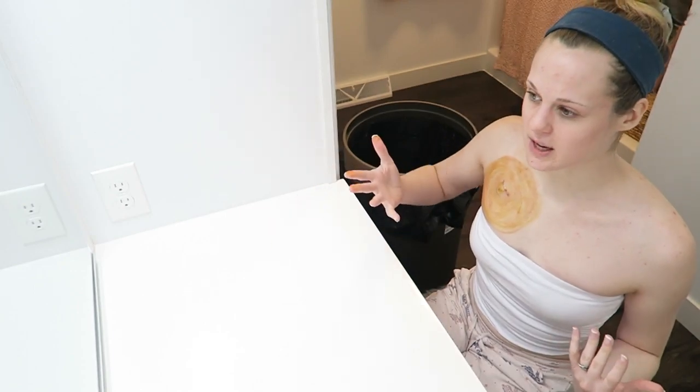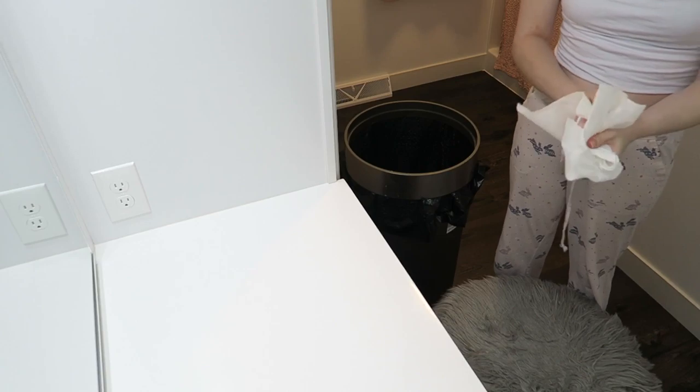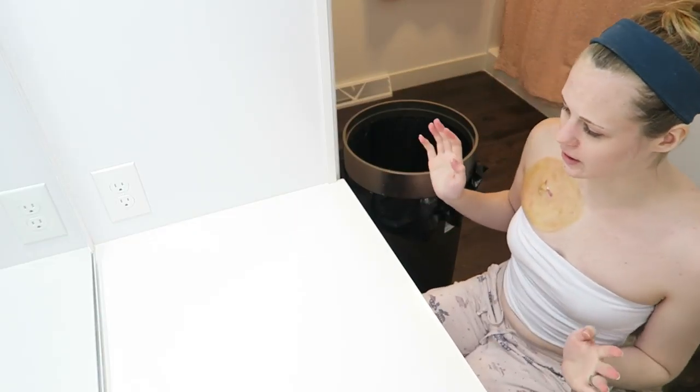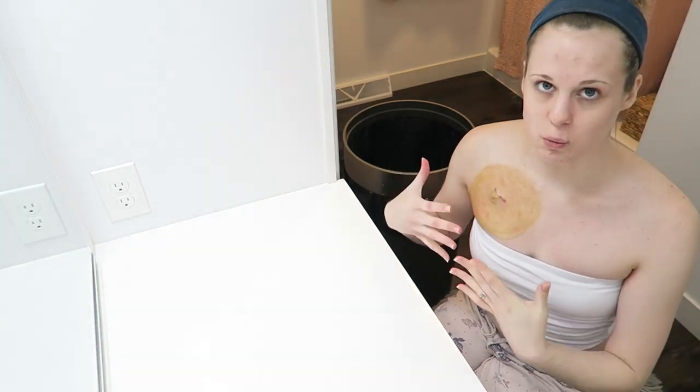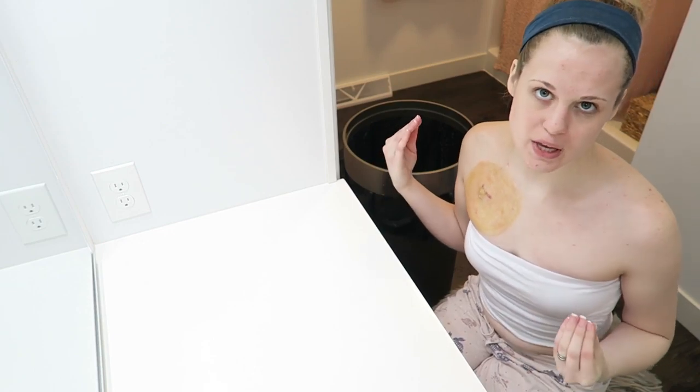So now that my hands have betadine on them, I'm actually just gonna go ahead and wash my hands again. Okay, so I'm just going ahead and drying my hands again with some paper towel. Okay, so now we're gonna go ahead and set up our sterile field. We're gonna do this while the betadine is drying on the skin because you wanna make sure it's completely dry before we wipe it off.